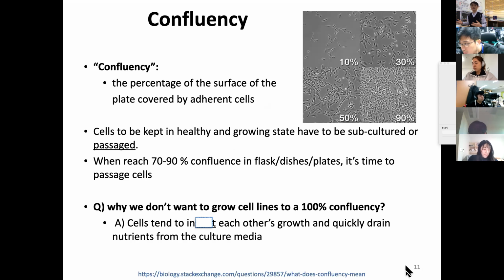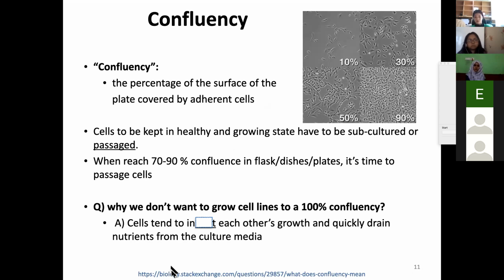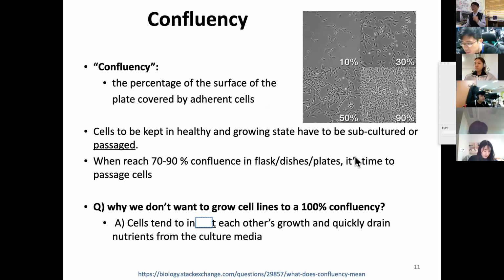And they can accuse you, hey, you guys published this, I wasted 5 years of my PhD just to reproduce what you have published. You don't want to be in that condition, okay? So it's very important to understand that primary cells can change their phenotype over the number of passages. That's why, at least for internal consistency and information, you'd better keep track of the passage number.